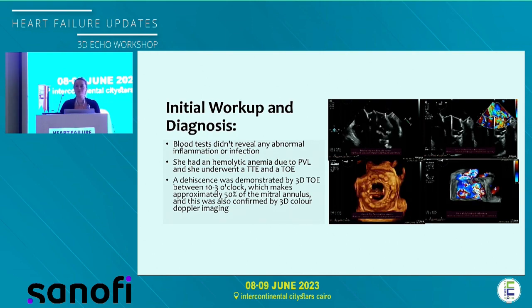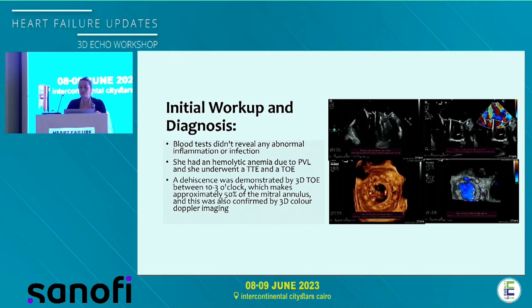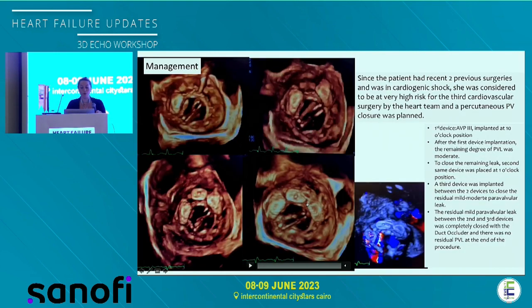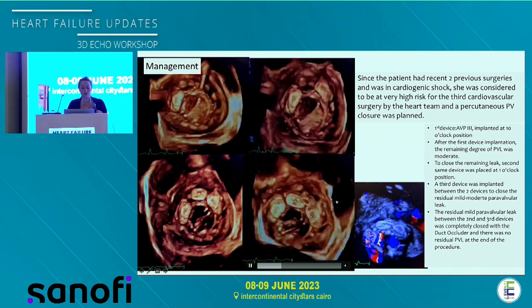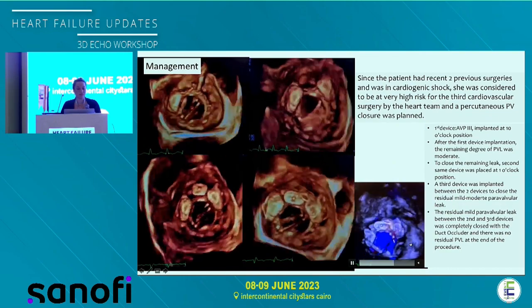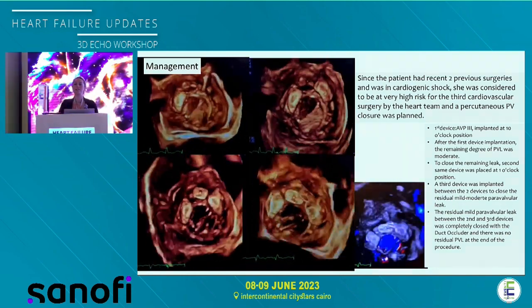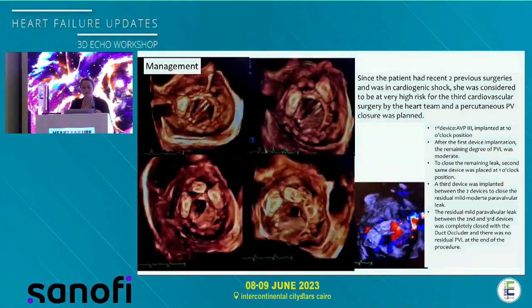This patient came from Cyprus to our center by ambulance plane, and we had to do it. Somehow we achieved it, and after 4 devices, you can see that we put 4 devices one after the other, and at the end there was no residual mitral regurgitation. This was, I think, 3.5 years ago, and the patient is still alive and comes to control, and she's very happy and doing everything, so we are happy too.